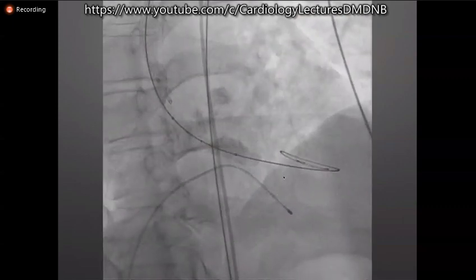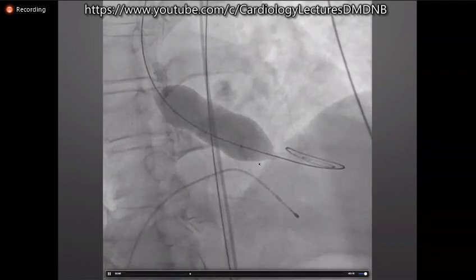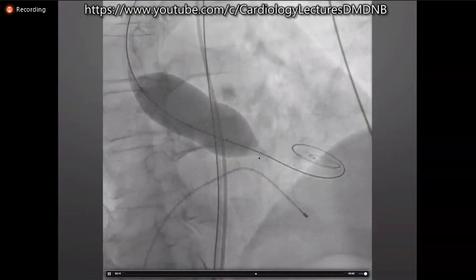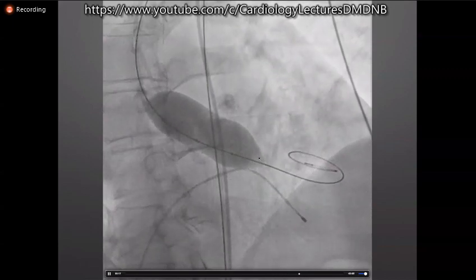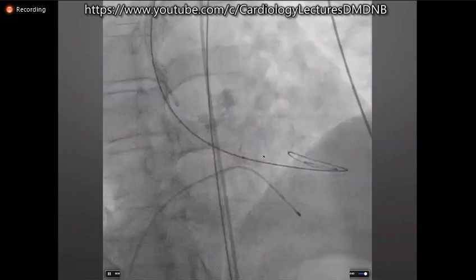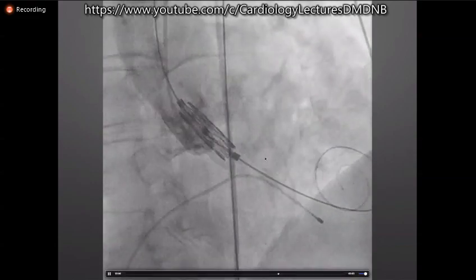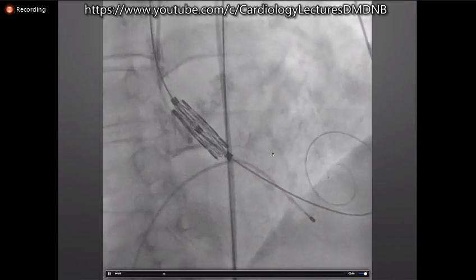We started the procedure, and at this time we thought that predilation with a 26 balloon may help us cross the valve later on, and it will help to open the valve. As you can see on the left coronary cusp, there's still an indentation of the balloon because of the severe calcification. We had no issues crossing the valve with the delivery system. Unfortunately, we didn't save the implantation image in this case.